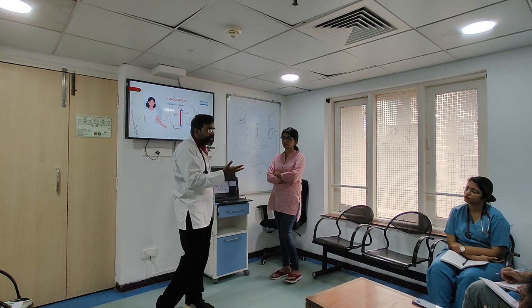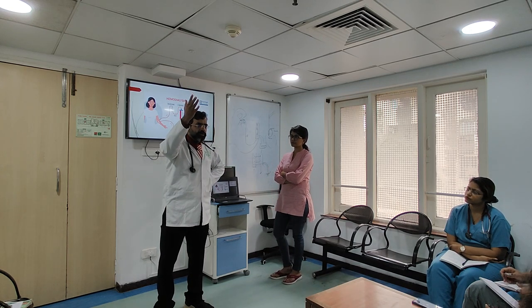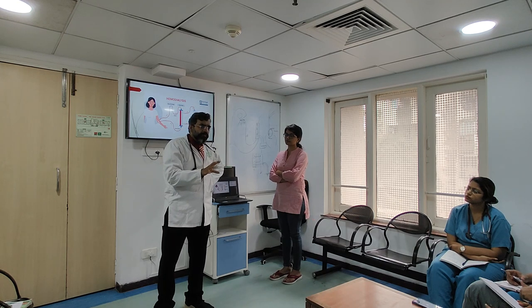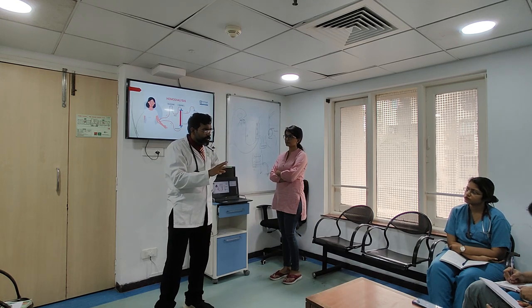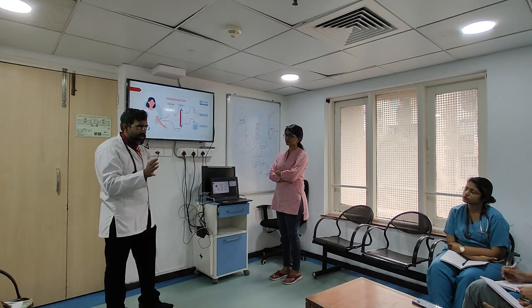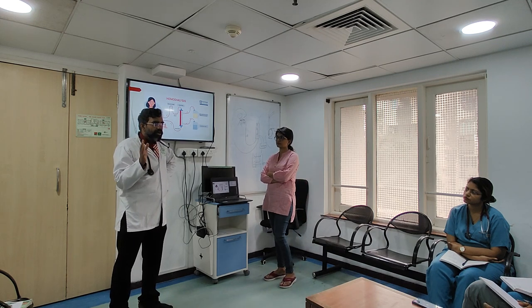There are a lot of portable ROs. So for example, if you don't have the facility to build a very large reverse osmosis plant, there are portable ROs that are available in certain hospitals. But what we use in CVVHDF is not that. In any kind of CRRT modality, we don't use the RO. We can't use the RO.